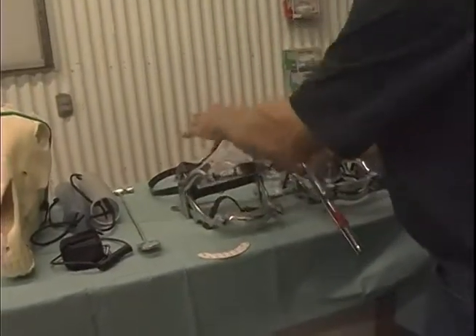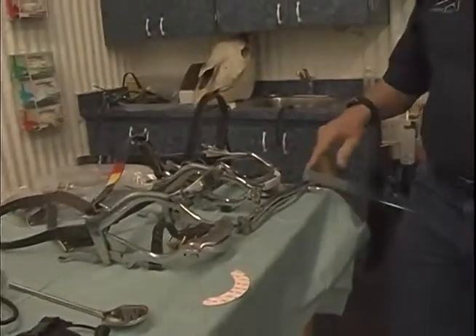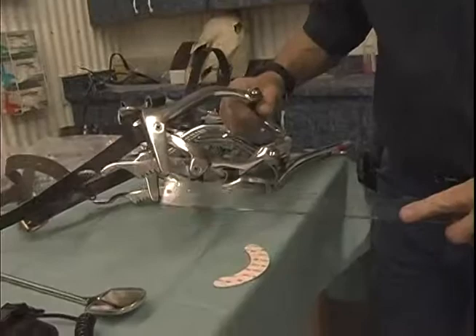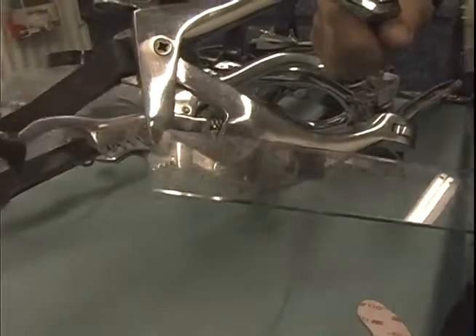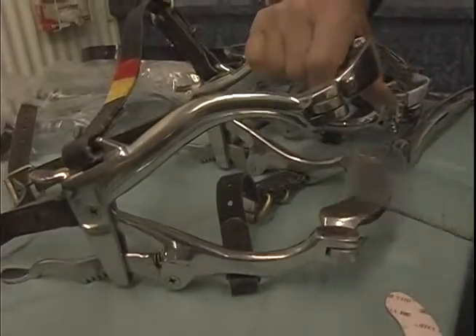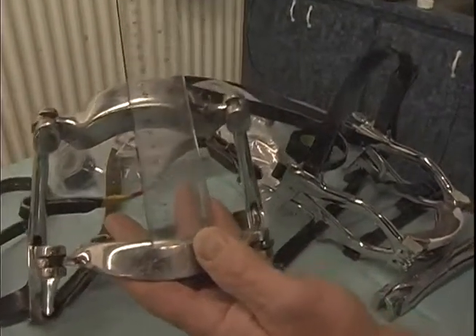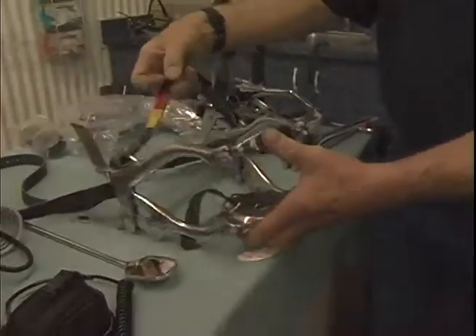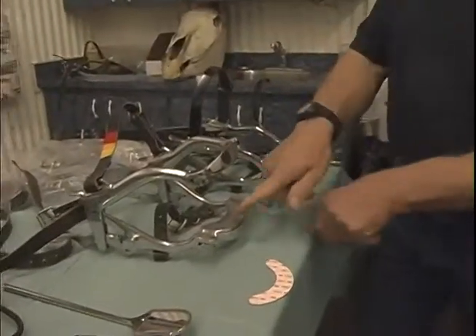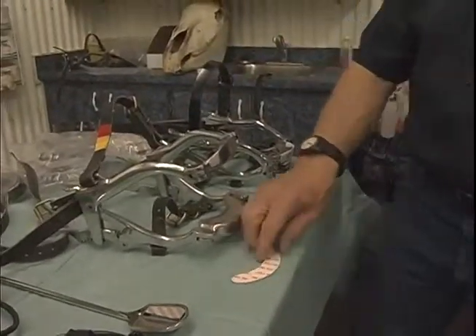This is one of the clinic speculums, and I just want to show you, this is open now, it's in the 5th notch. And the 5th notch gives you an approximate opening at the front of 9 centimeters. It's important to be able to have a speculum that can open to 9 centimeters so that you can gain access into the back of the mouth where the hooks are.